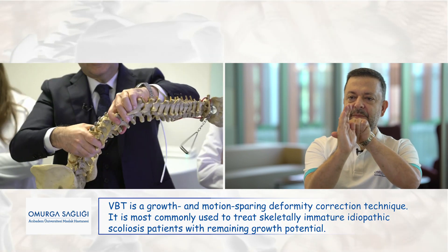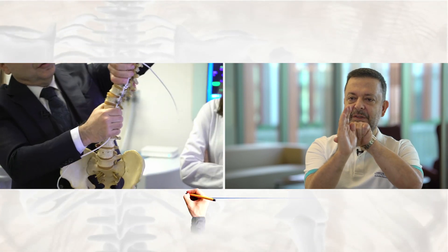How is that achievable? Imagine this is our curve. It has a convex side and a concave side. We place vertebral body screws on the convexity and place a tether and tighten. The applied force results in a deformity correction. However, the aim is not to have a full correction. Instead, the remaining growth potential of the child urges more growth on the concavity, thereby lessening the deformity. Thus, a time and growth dependent spontaneous follow-up correction occurs.